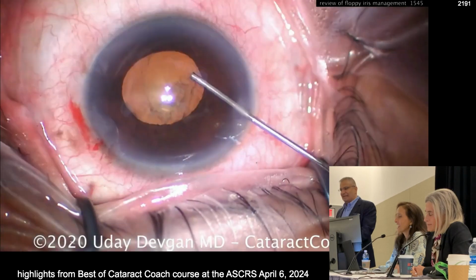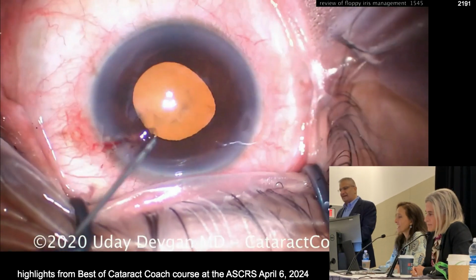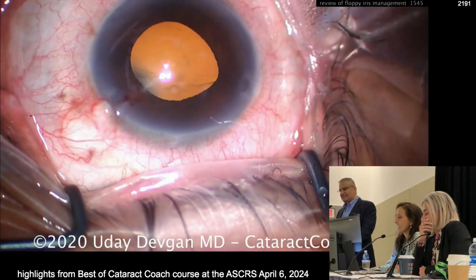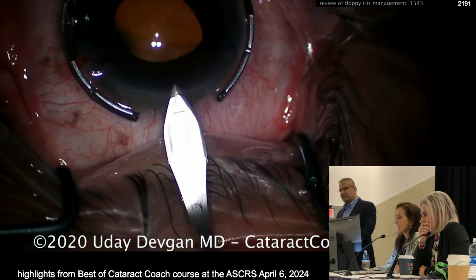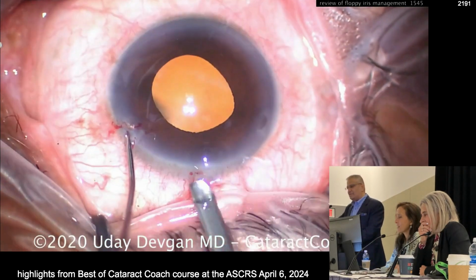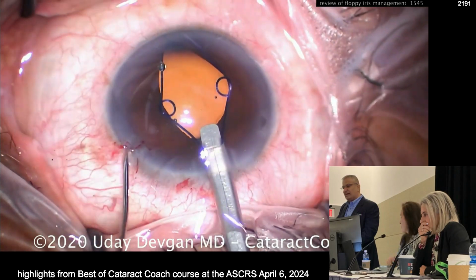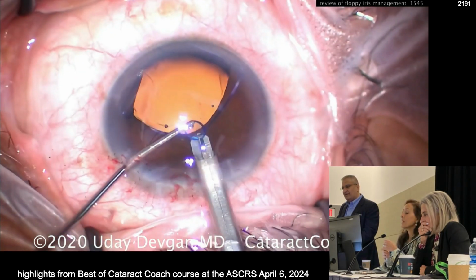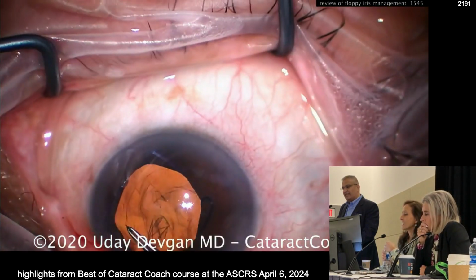And now some viscoelastic. And I'll make our incision. We're sitting superiorly here because this patient's got a bit of with-the-rule astigmatism, and I want to make the incision on that axis. So we'll make the incision here, and yeah, I'll put in the expansion ring, for sure. And then the way I like to put the ring in, you saw I put little tiny aliquots of viscoelastic underneath the iris. So there's the leading eyelet, here are the two side ones. I'll adjust the iris here, make sure I get, there you go. I got 3 done, and then there's the 4th one, bam, done. Nice. So all in one, get that thing done.